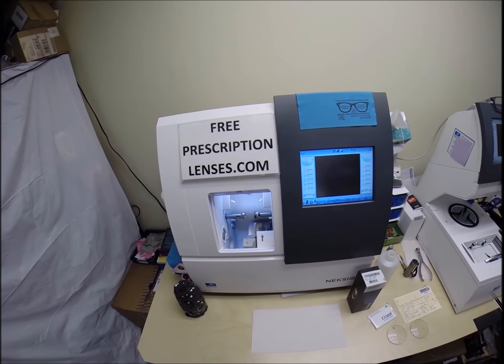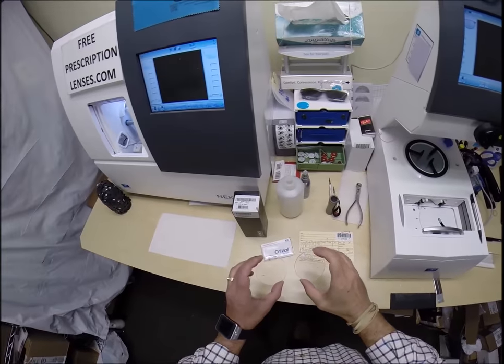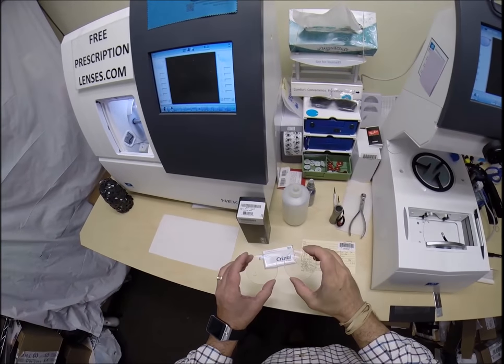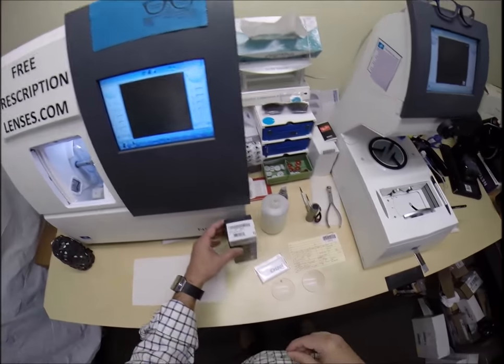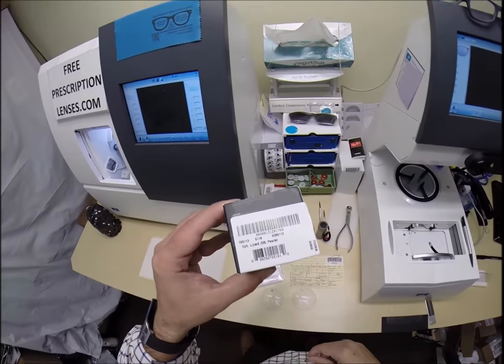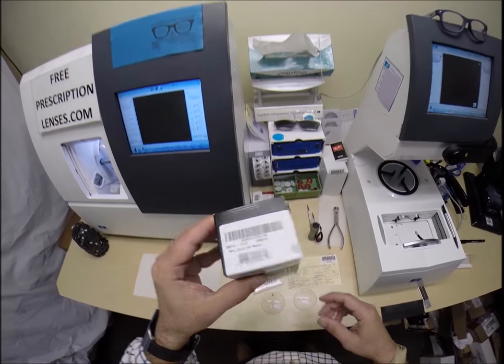Seymour Better here with FreePrescriptionLenses.com. Today I'm going to show you how I cut a pair of invisible bifocals with transitions gray lenses and Crizal anti-glare for one of my patients — the Oakley 5113 in the Lizard color 02, which is the pewter in the 56 eye size.